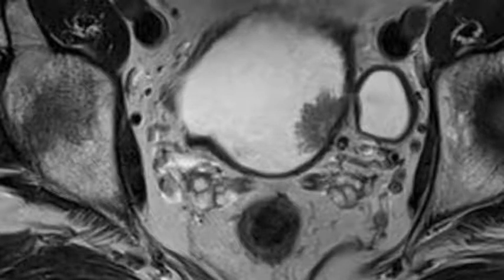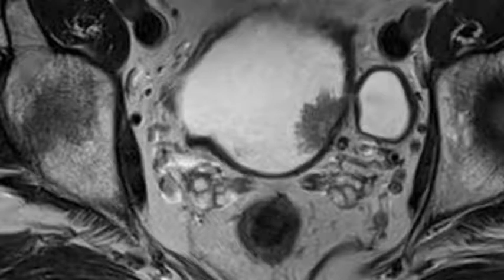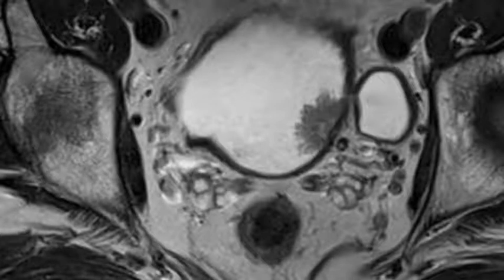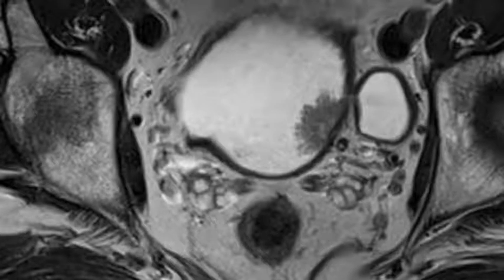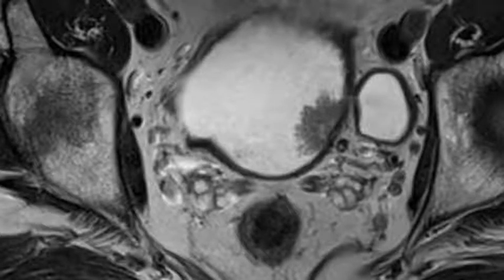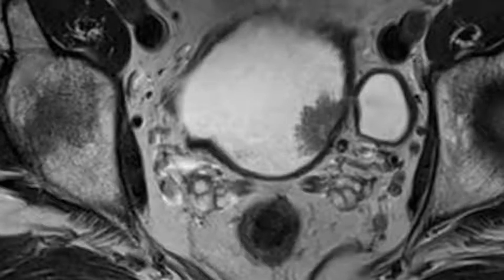Microscopic perivesical spread, stage T3A, cannot be identified at either CT or MR imaging. Macroscopic perivesical disease, stage T3B, can be confidently diagnosed at CT only in the presence of moderate tumor volume outside the bladder. Perivesical fat stranding may often be seen following the treatment of bladder cancer due to surrounding edema or inflammation and does not necessarily signify stage T3B disease.